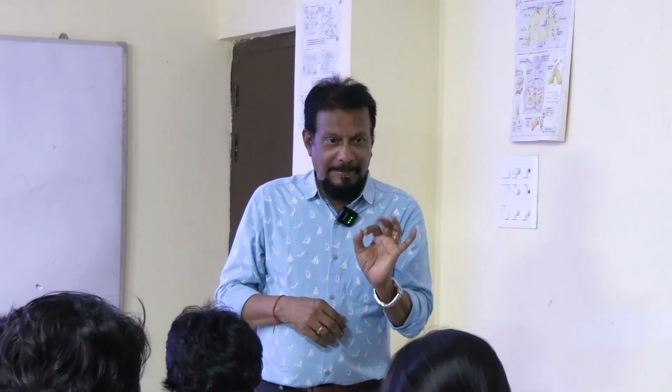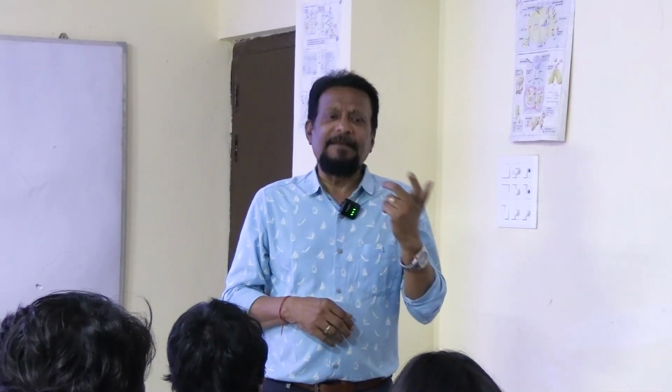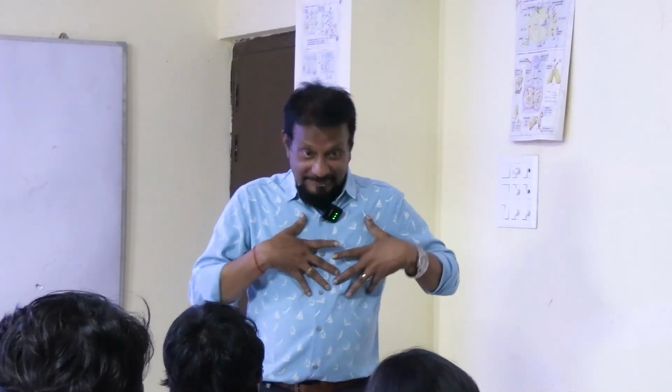If you are expert in studying ST segment, you can easily identify ischemic heart disease, ischemia, pain.